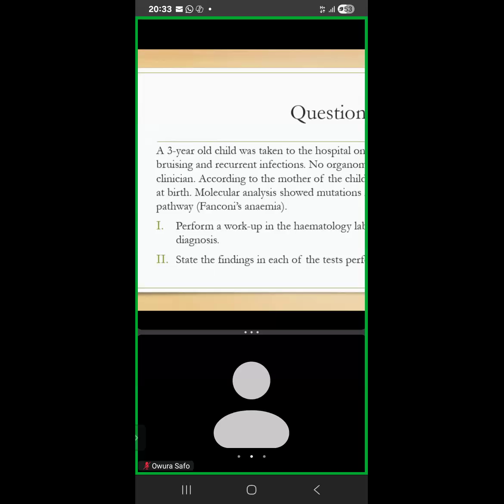It's the same thing. It's still science. So screening tests are the ones that are available to us readily. And so we want to see how best we can use them. That is why when we see abnormal white cells, for example, that are supposed to be in the bone marrow, we want to query and suggest a bone marrow aspirate or a trephine.